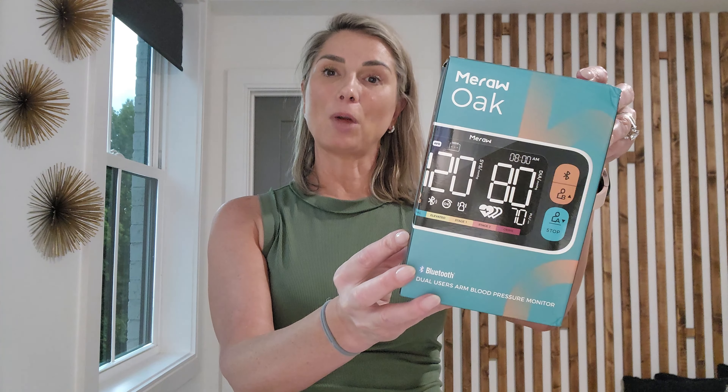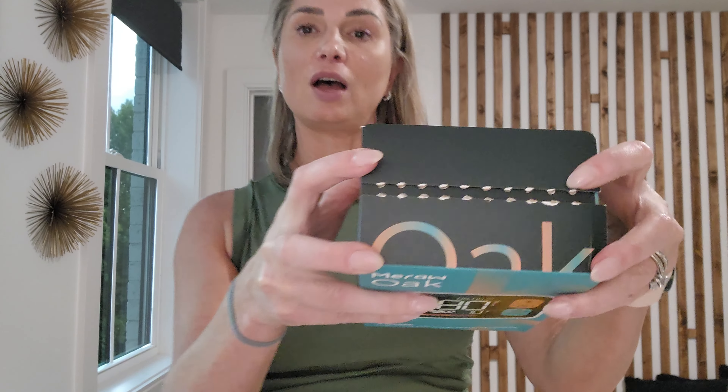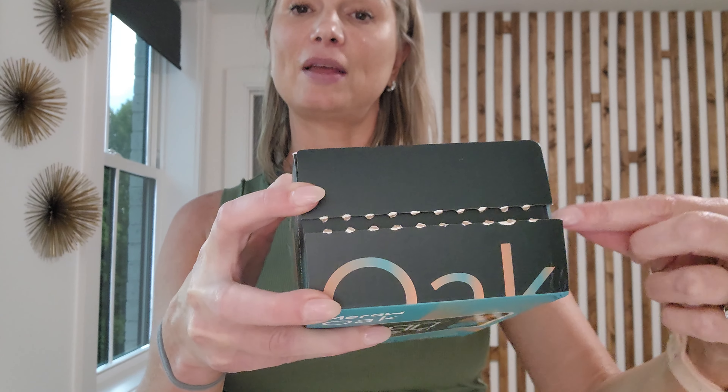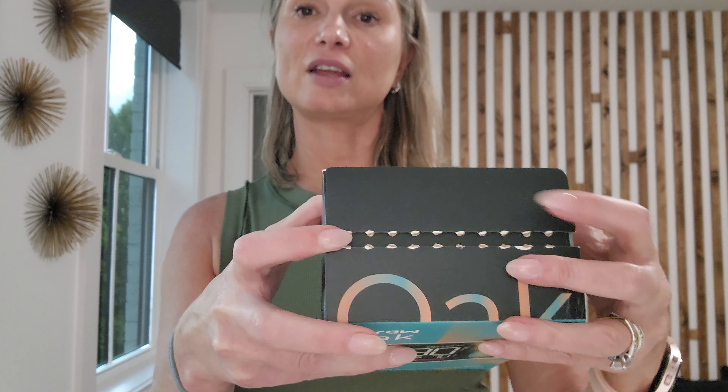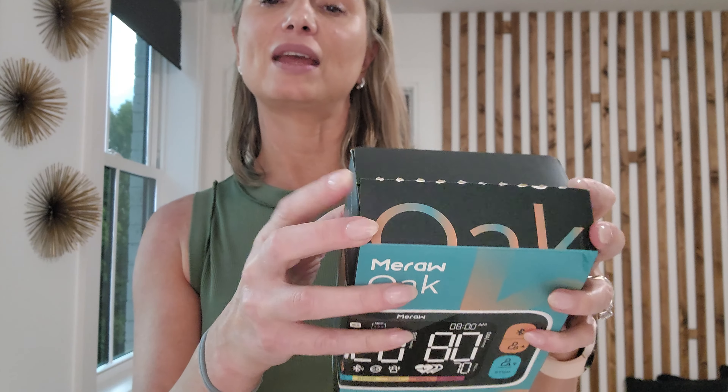Here is the Maraoak blood pressure cuff that we got sent from Amazon. This is the box, and I wanted to show you something very unique — on the top you'll notice there are perforations with a tab you have to pull off to open the box. I've already opened it because I wanted to test the product before this review. This is very important because it means the device you receive has never been used or tampered with.